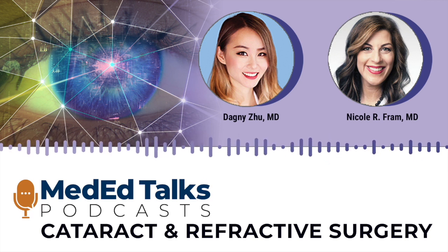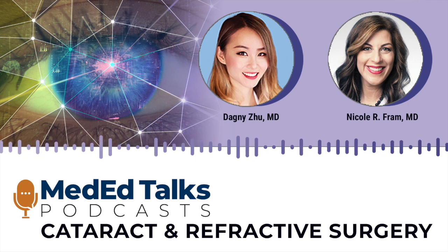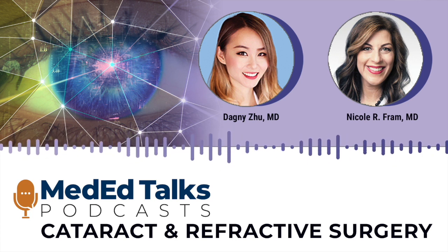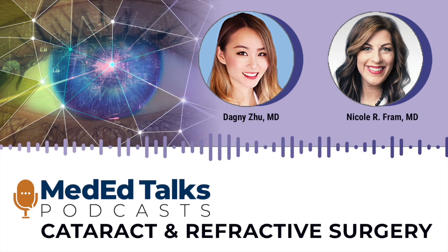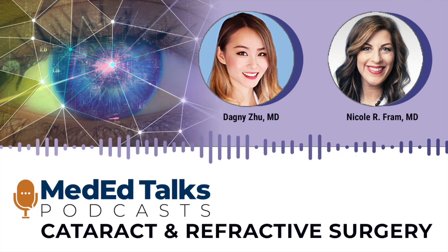So as a refractive surgeon, I actually find intraoperative OCT to be very helpful from a refractive standpoint, especially when it comes to ICLs. Right now, it's still a little bit difficult to figure out that ideal ICL sizing. And being able to insert the ICL and see what kind of vault you're getting with that patient's anatomy, and know whether you have to exchange to a smaller or larger size, would be extremely helpful.